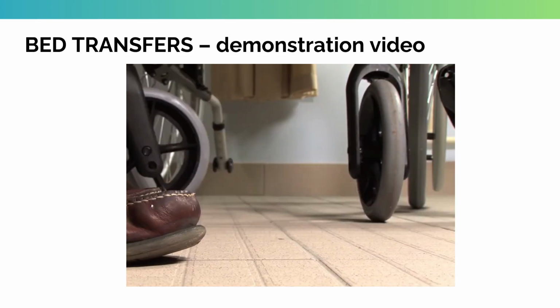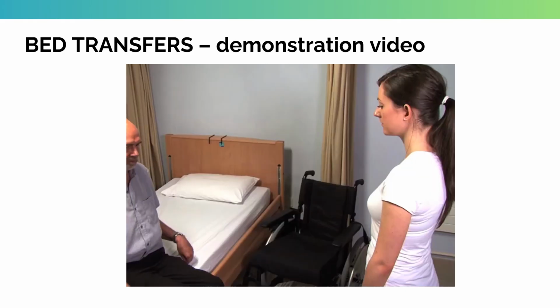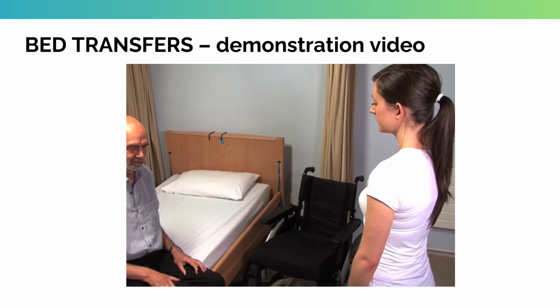In this position, they reach back with their hands, bend at the hips, and lower themselves down until they feel the bed underneath them. From this position, the wheelchair user can lower themselves onto the bed. To transfer from the bed to chair, the same procedure is followed.